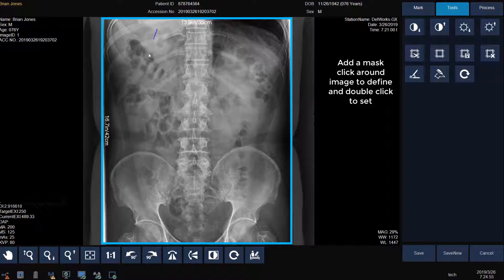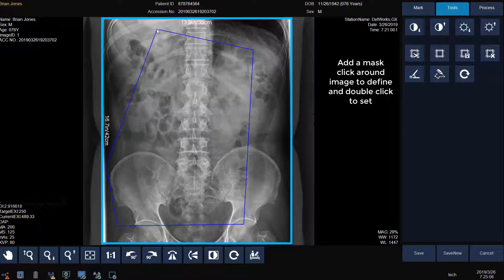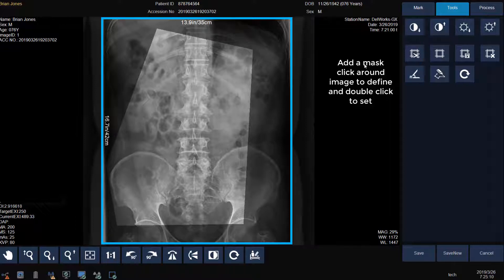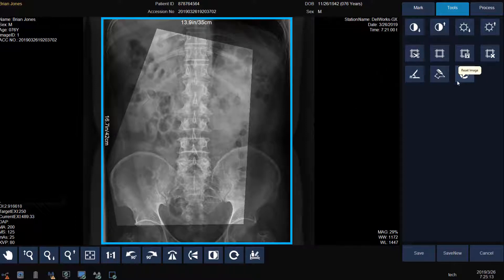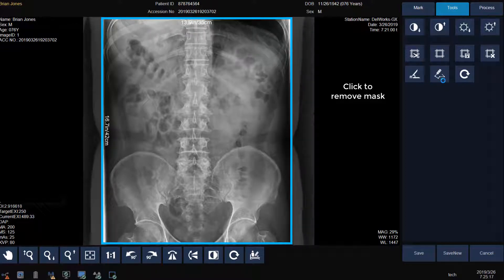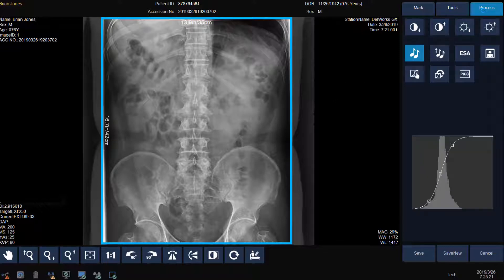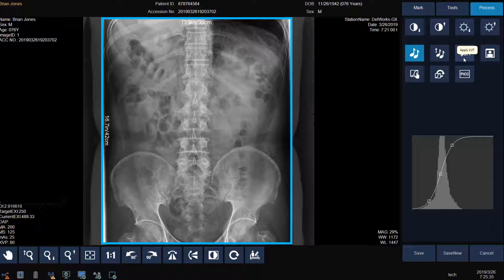We can also add a mask around the image. To do so, click on the mask icon and then click as many times as you need around the desired area on the image. Double click where the two lines join to apply the mask. To remove the mask, click on the mask icon again. Less commonly used tools are available under the Processing tab. You can adjust brightness and contrast, change the image processing algorithm used, apply a lookup table, reprocess the body part as a different body part, redefine the processing curve, or reset the processing curve.